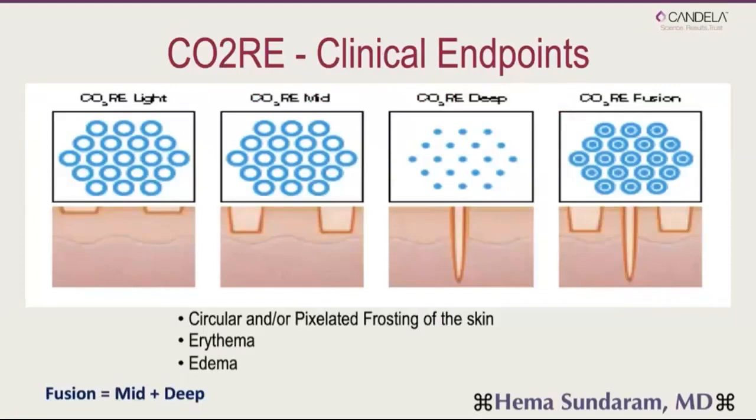Now we can vary the shape of the resurfacing that is being delivered, but here we see just the different modes that we can use. The core light, which I use for what I call to patients a laser micropeel, and we can use it in thin-skinned areas of the face as well. We have then a mid modality, which is mid-level, as that name would suggest, and we have a deep modality. And then we have a modality that I use the most in my clinic, which is the fusion, which is a combination of the mid and the deep.